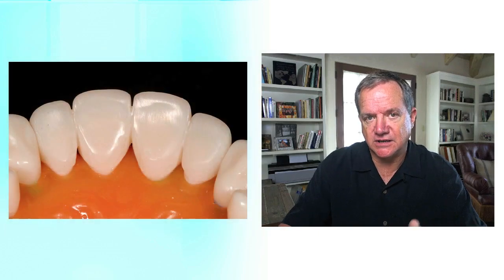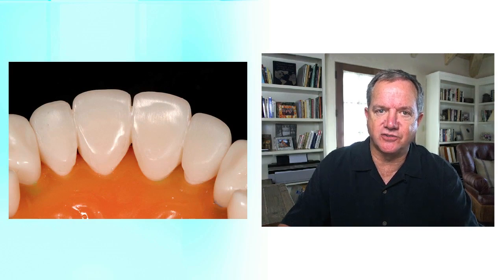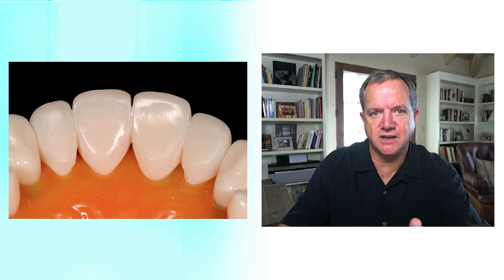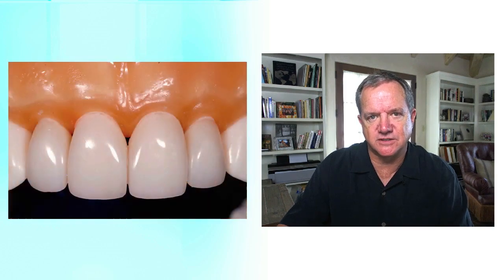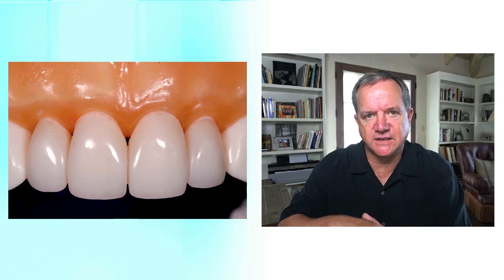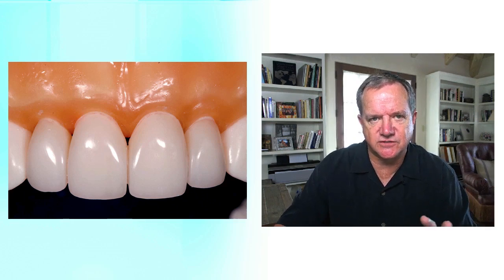There's the lingual concavity that's placed, and obviously you have to pay attention in the mouth to occlusion when you do that. So you have to have your centric stop and then you get your guidance. But we don't want flat surfaces or convex surfaces. We want concave lingual surfaces. And there you can kind of see the form of the temporary itself. The way the light reflects off the facial surface gives you an idea of the luster that comes from the pumice and comes from the Ivoclar polishing paste.